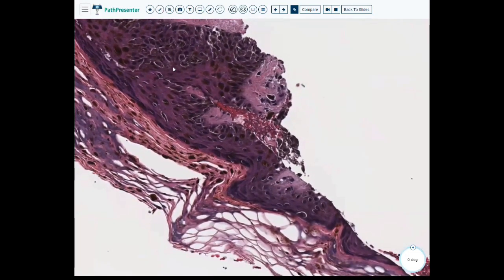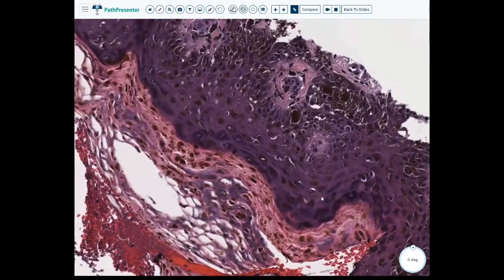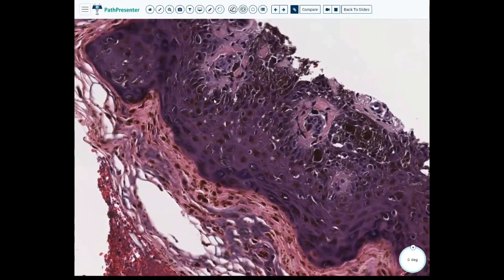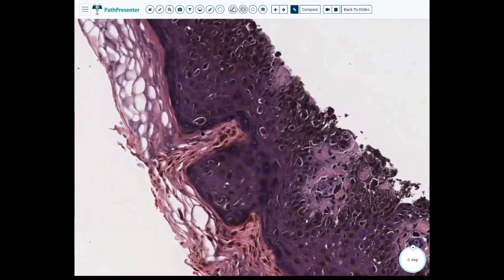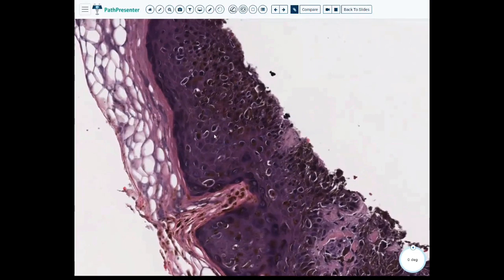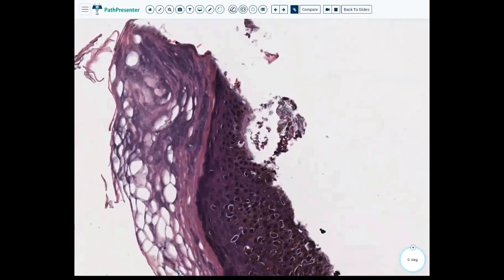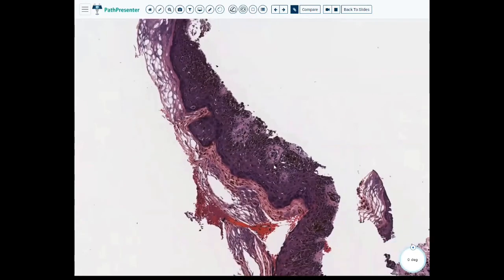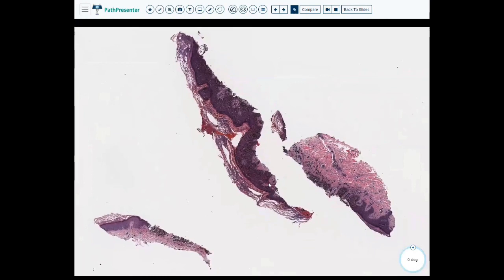But you shouldn't see melanocytes so far up in the epidermis, right? They should all be within the basal layers of the epidermis, and here we're seeing them come all the way through. We have these pigmentation granules that are going straight through our superficial keratin or orthokeratin layers. So since again it's extremely superficial, this is at least melanoma in situ.